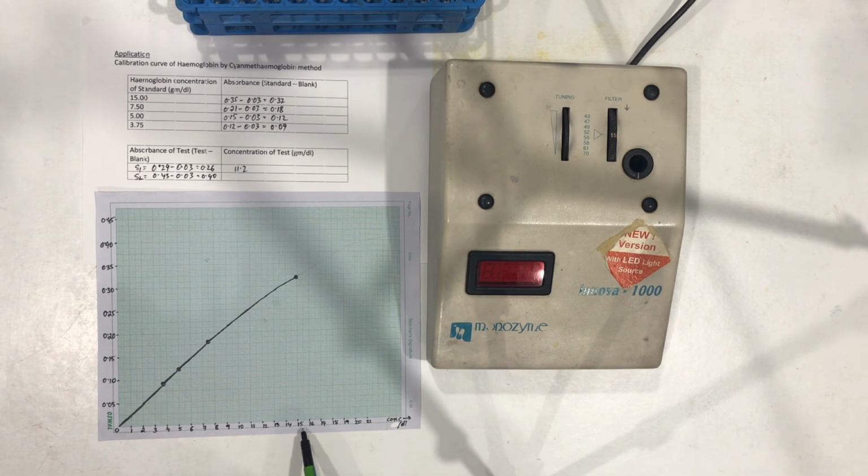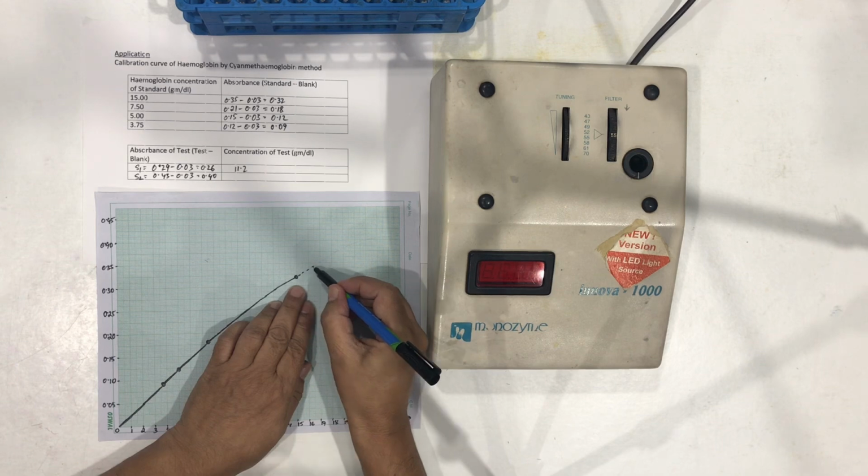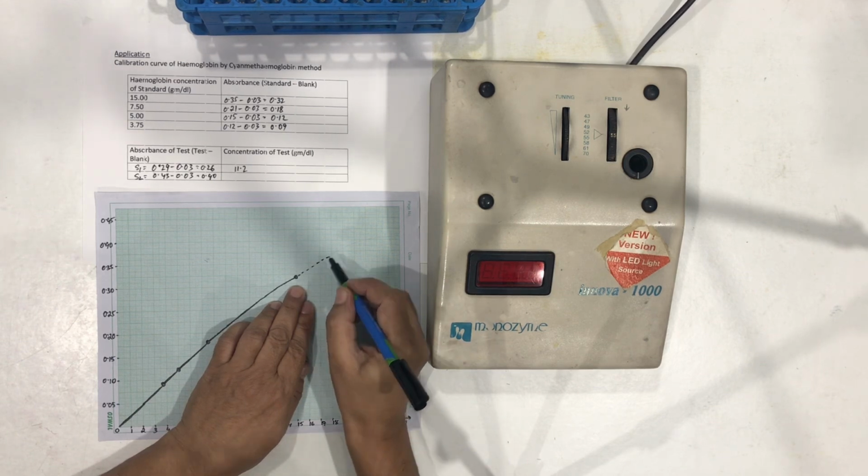Out here, as we keep on increasing the concentration, the curve slowly becomes non-linear.